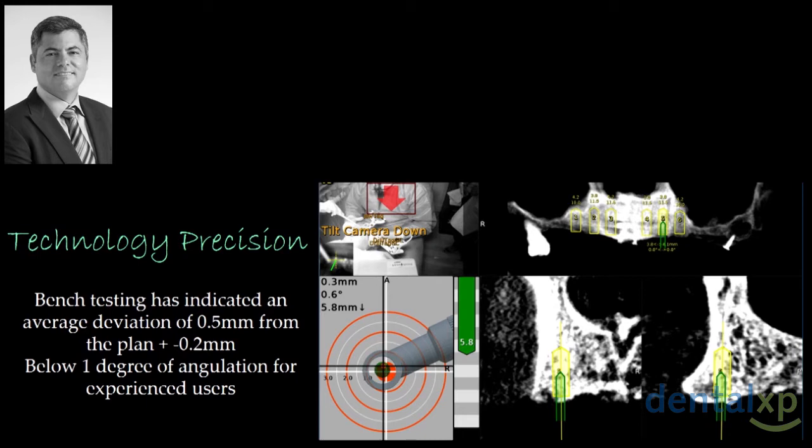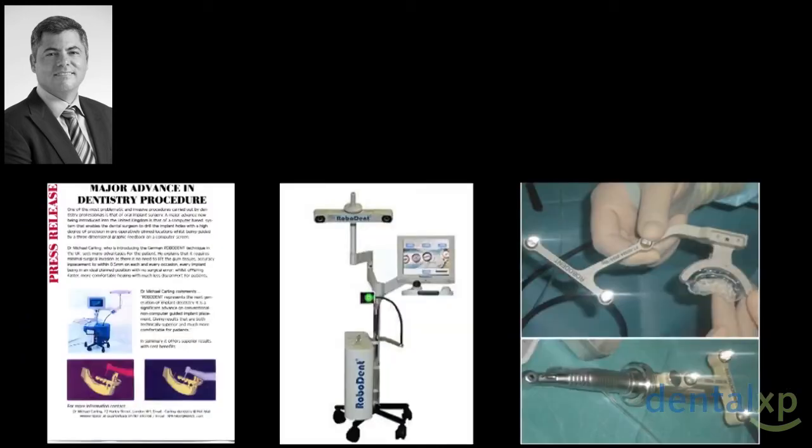Once you develop the idea of situating yourself in the three-dimensional environment, you are super, super precise. It takes some time, it takes some practice, it can get discouraging and frustrating, but if you keep on working on it, at some point you develop a feeling and you work by feeling pretty much, and it just flows like it flows when you freehand your work in your practice doing any of the other techniques.